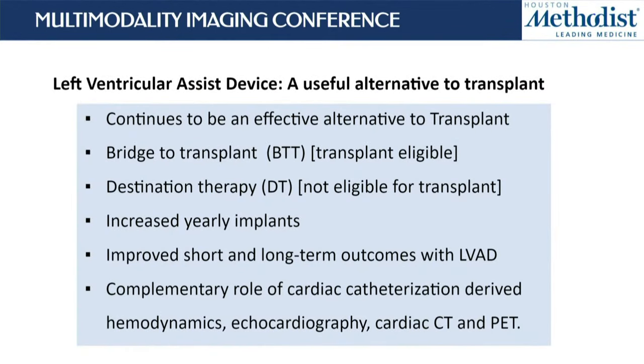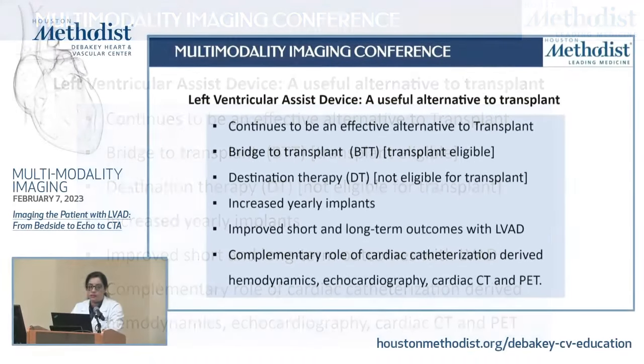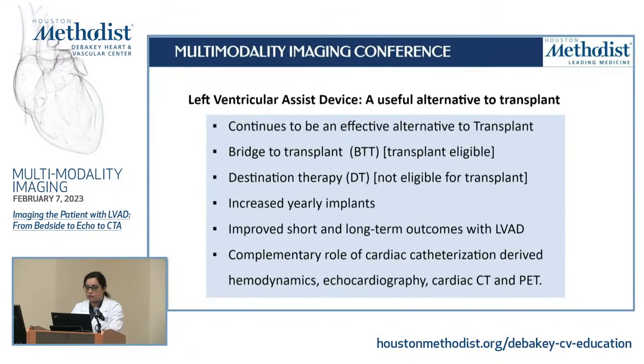We all know that LVAD is a useful alternative to transplant. It continues to be an effective way to bridge transplant patients, and also used as destination therapy, and a wide array of patients are on destination therapy in the United States. We have had increased yearly implants, and great long and short term outcomes, particularly with the new MOMENTUM 3 trial, the 5-year outcomes are excellent, so we're looking at longer survival, really reduction in hemocompatibility-related adverse events, particularly pump thrombosis that used to be a big alarming situation for us in the past.